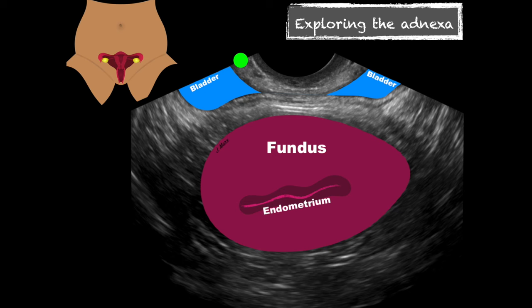Sometimes with an anteverted uterus, we can see the ovaries right there, and that's normal. I'm going to look for pathology in that area because that's going to be our adnexa. Remember, we shouldn't see the fallopian tubes — if we do, that's typically abnormal. We want to look for any structures: whether a fallopian tube is identifiable, or adnexal masses. The other ovary can be out on the other side. Ovaries can be posterior, and I have seen them anterior on a retroverted uterus, so pay attention to that.